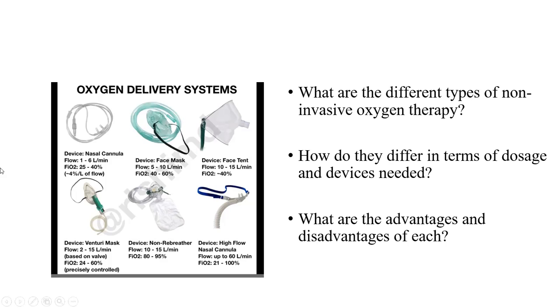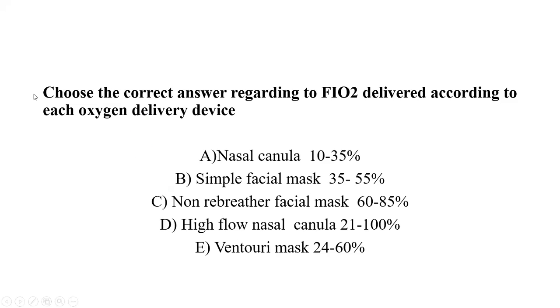Okay, we have a question asking to choose the correct answer regarding the FiO2 delivered according to each oxygen delivery device. A said nasal cannula can give 10 to 35%. Is it true or false? False.